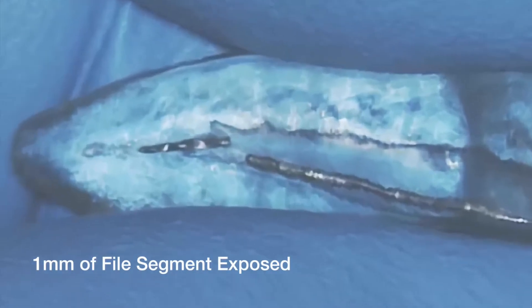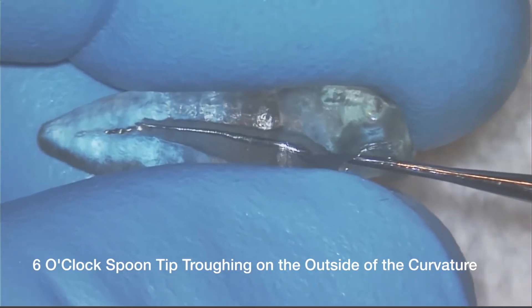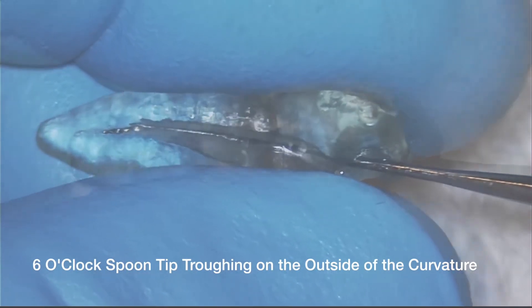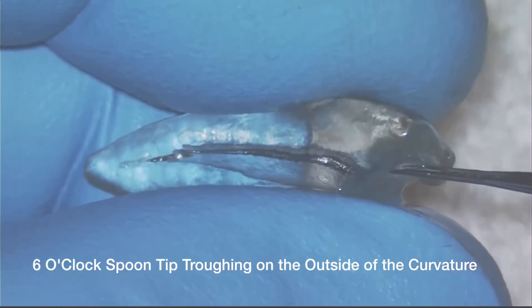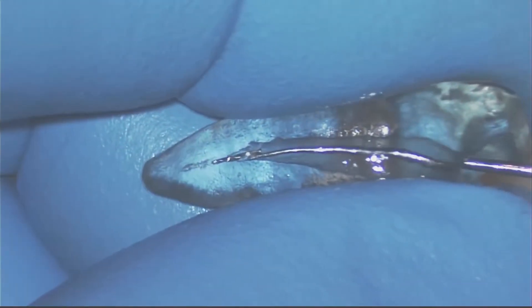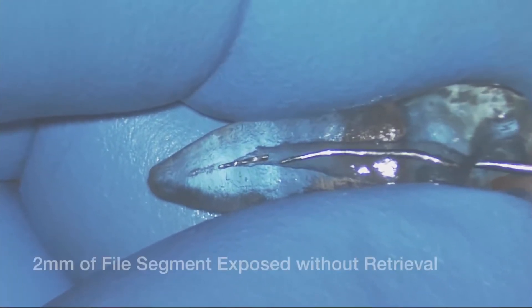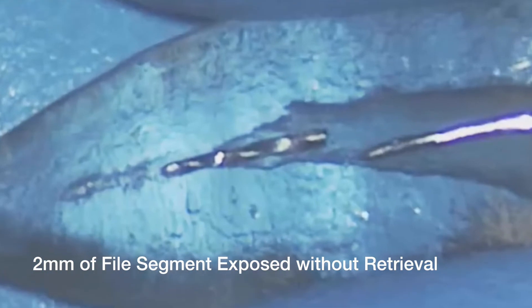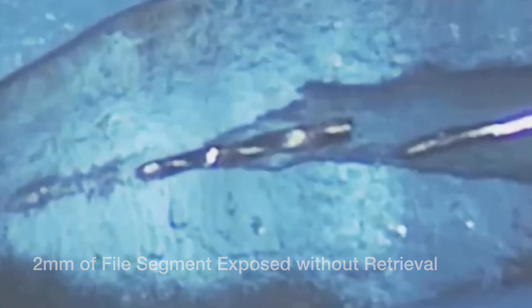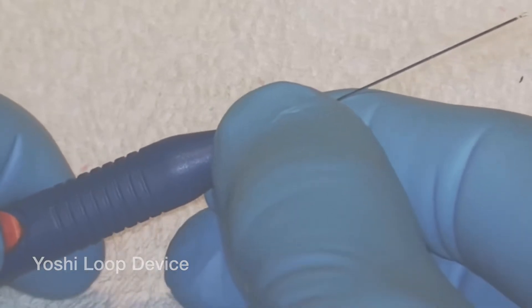It doesn't look like it's going to come out yet, so let's see if we can get more of the file exposed. I'm going to use the six o'clock spoon — the spoon's facing towards the handle — to trough a little bit on the outside since we already have the inside taken care of. Now I'm back with the spear on the inside of the curve giving it another try, again in the presence of EDTA solution, and the darn thing isn't coming out. So we bring in the big guns: the Yoshi Loop device.